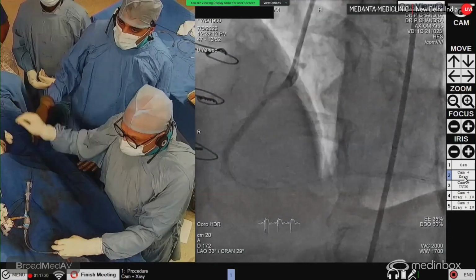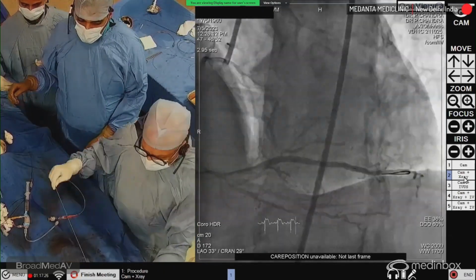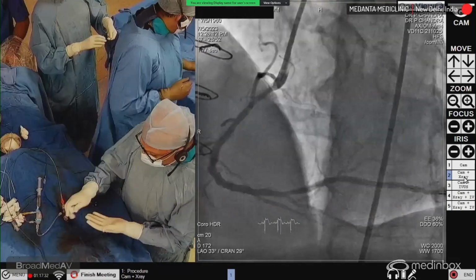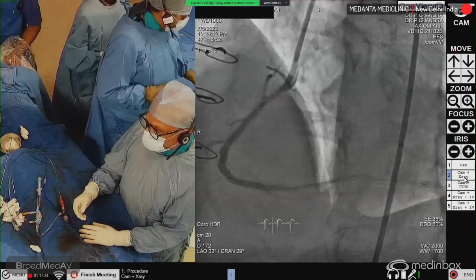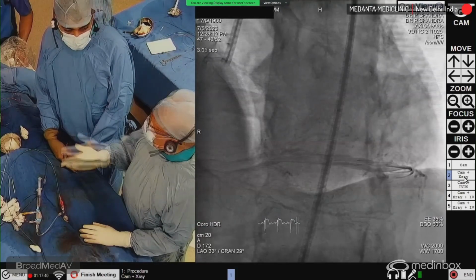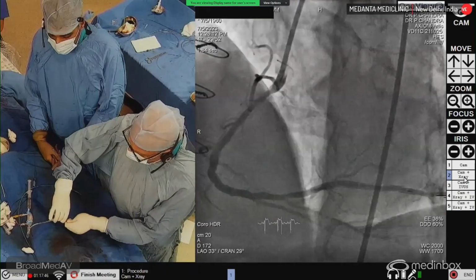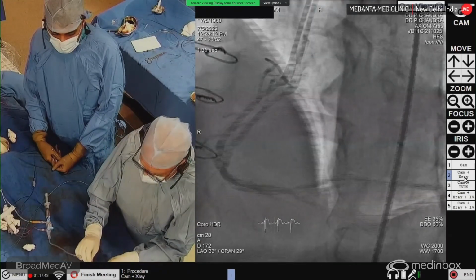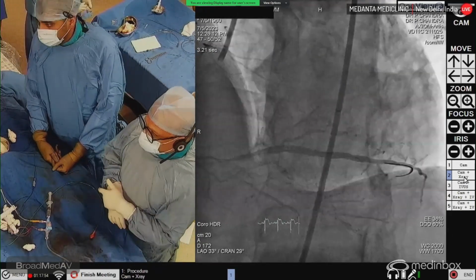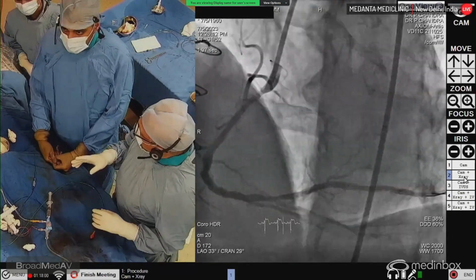So I'm taking everything out. Doing a laser up front in a very tight stenosis of a vein graft, if we have to do it, is a good idea. Because you cannot put a distal protection, and if you do a balloon dilatation, there is a higher chance of distal embolization and slow flow. So that is why it is helpful. And in degenerated vein grafts, we have seen quite good outcomes. The patient's pressure is good, his ECG is stable, and he is absolutely stable. So we will now stop here.